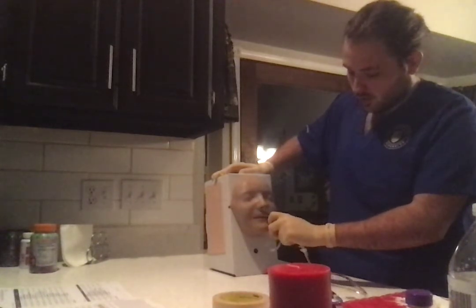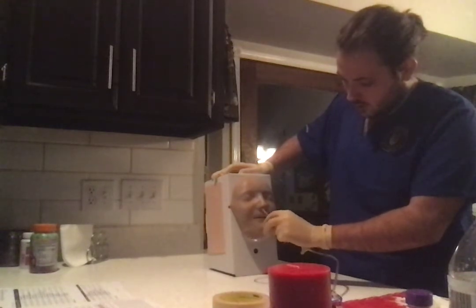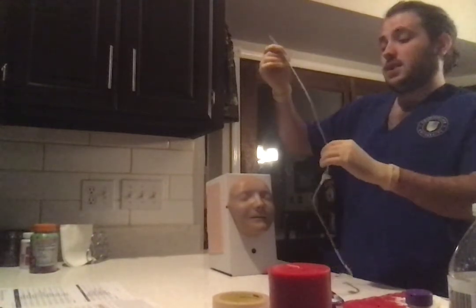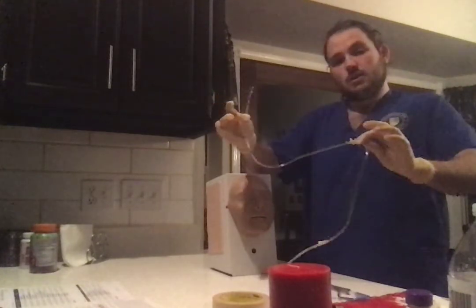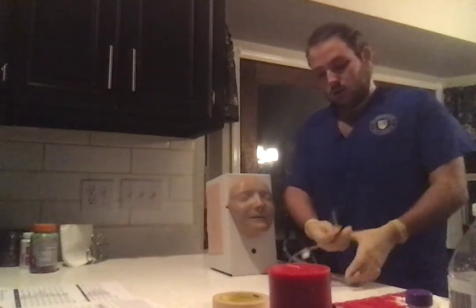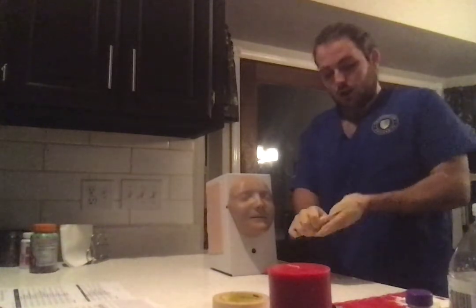It's not a pleasant experience. Control the tube as you pull it out so we don't spill any gastric contents. It is acidic. Confirm that the tube is intact. Nothing is wrong with the tube. Alright, we would then discard our tubing and our gloves.